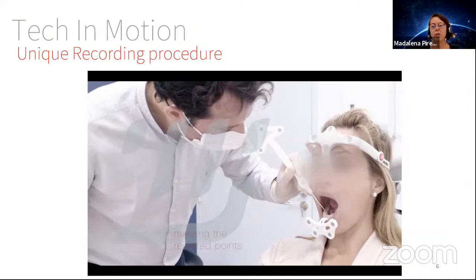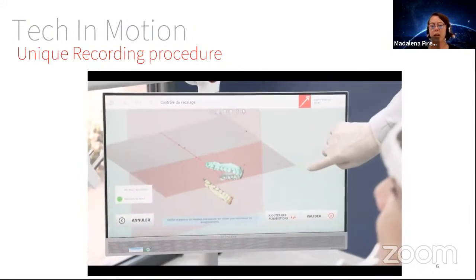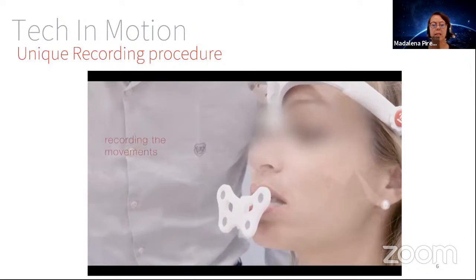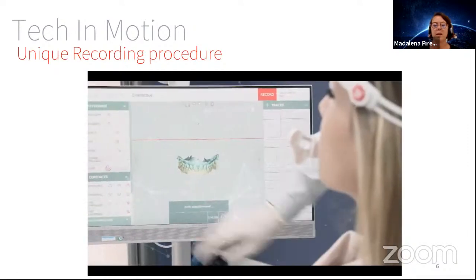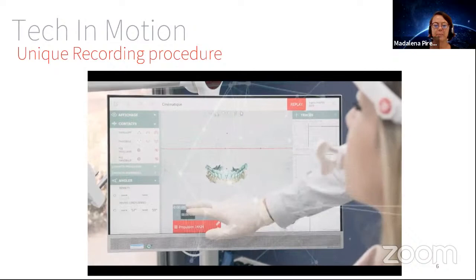This allows us not to have a marker like our competitors, where you have to put a marker in the mouth and the workflow becomes quite complicated. And as you can see, as soon as the patient starts moving the jaws, we can see in real time the jaws moving in the Mojo software.